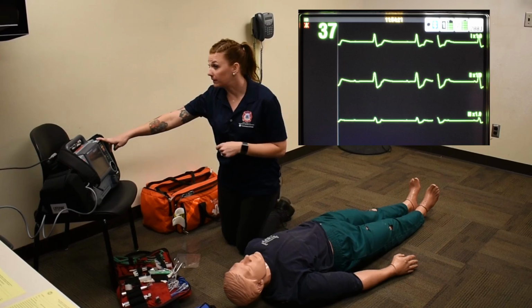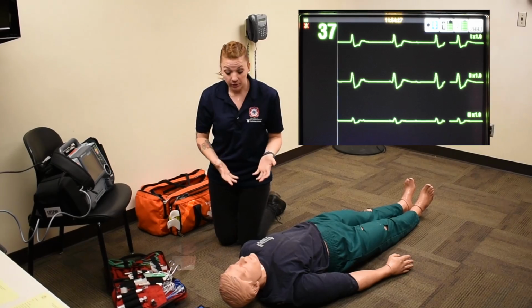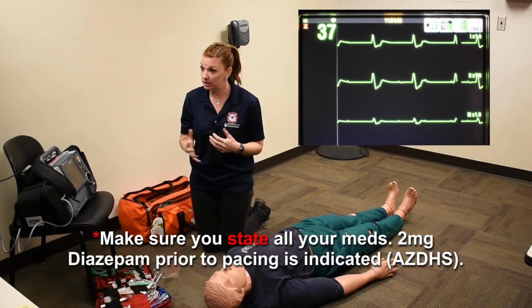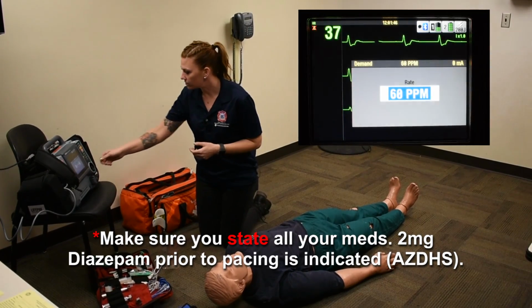Due to his instability and the way that his skin was looking, I want to go ahead and pace my patient. At this time, I'd let him know that we're going to be delivering electricity in his chest, that it might be a little bit painful. So we're going to go ahead and give him something to take a little bit of the edge off. Since I have that IV in place, I can go ahead and do that. And at this time, I'm going to turn my pacer on.